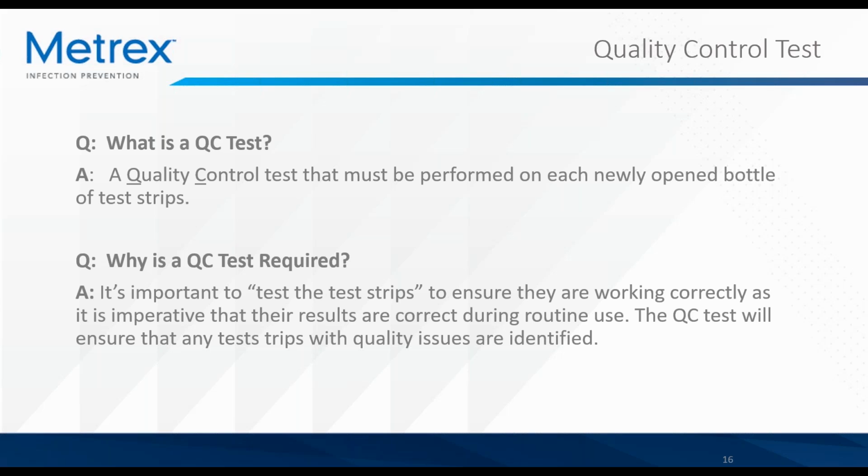high-level disinfectant solution. To demonstrate the procedure for the QC test, we have a video available on YouTube, and you'll receive the link in a post-webinar email, but I'm also going to share the visual now, and I'm just going to narrate myself since the sound doesn't come through well via webinar. But it's a great standalone video with its own narration if you like to see the demonstration each time you open a new bottle of test strips.